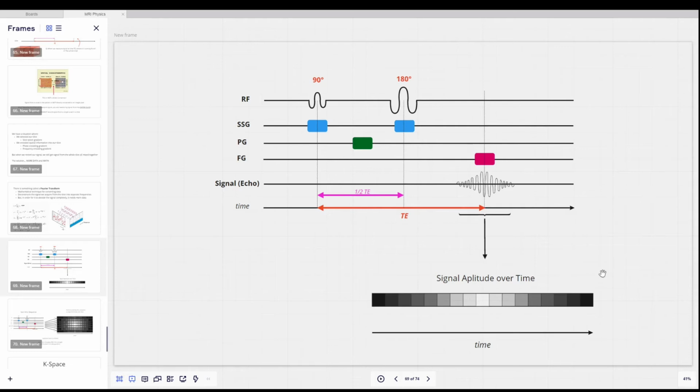You're not going to have as accurate a signal. But conceptually, when the computer is measuring the signal, it's just plotting how strong that signal is over time. So we run our sequence, and we get something that looks like this. And remember, this is not what our picture looks like. This is just how strong the signal is that we're recording over time as we're measuring here.